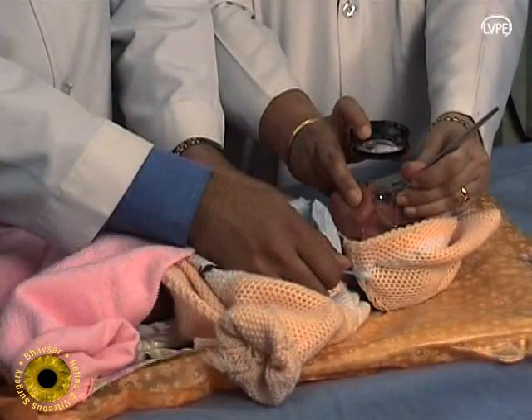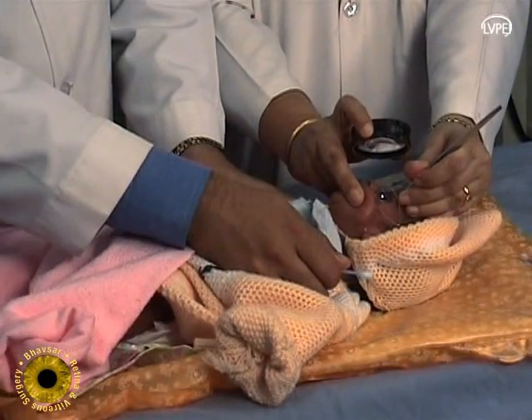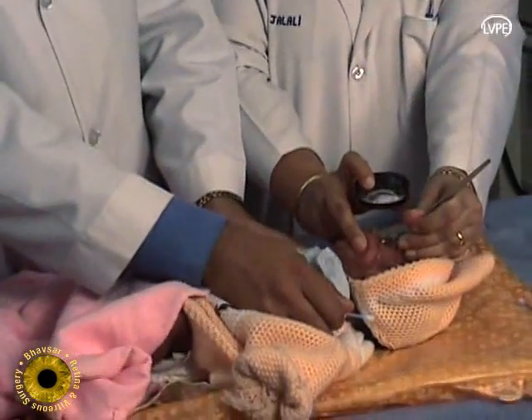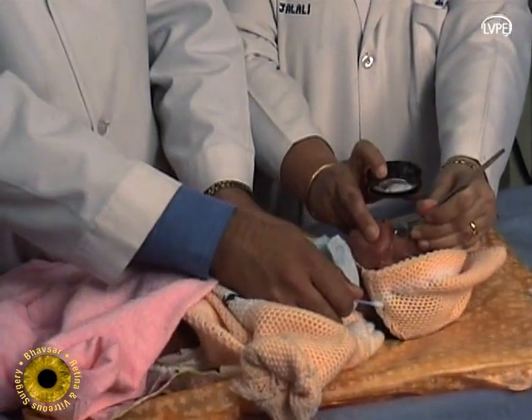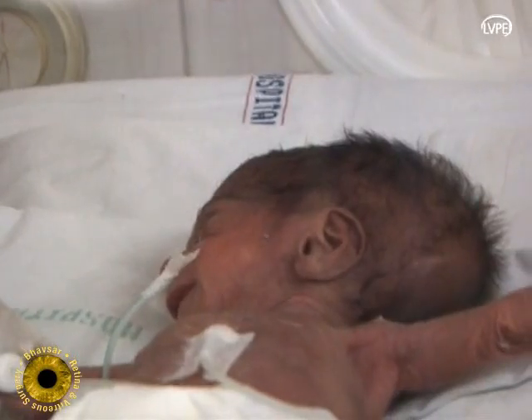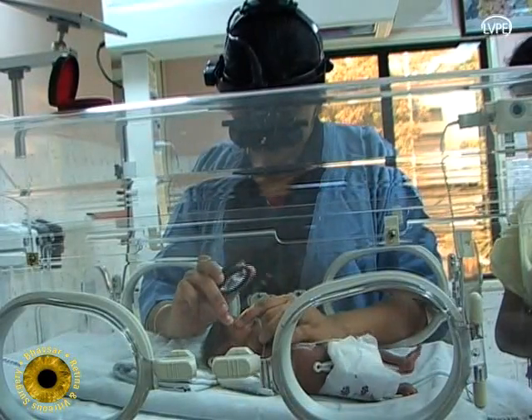These settings can be readjusted for individual eyes to achieve gray-white burns of moderate intensity. They will vary according to the area of the retina being treated and choroidal pigmentation. An assistant gently restrains the baby during the laser procedure. Usually the baby does not have enough strength to move a lot if the weight is less than 1800 grams.